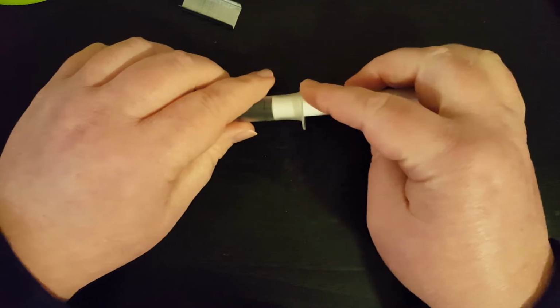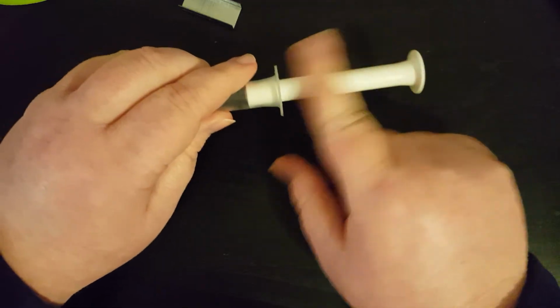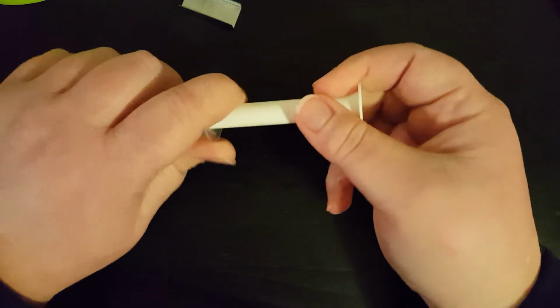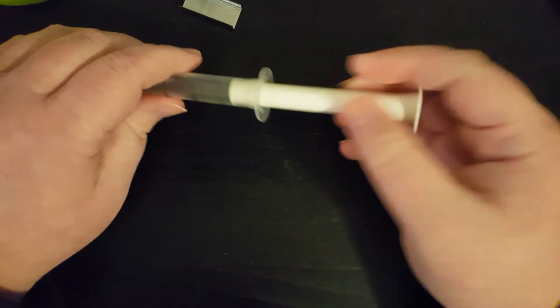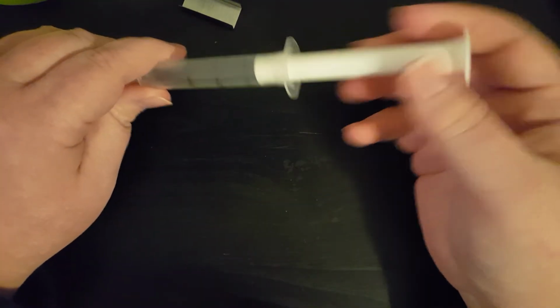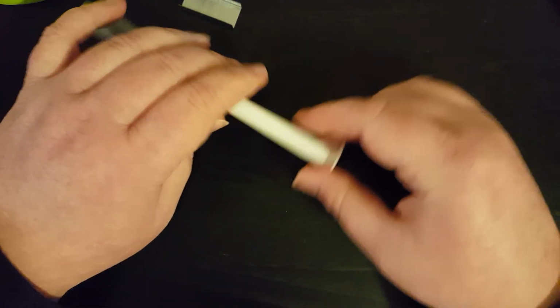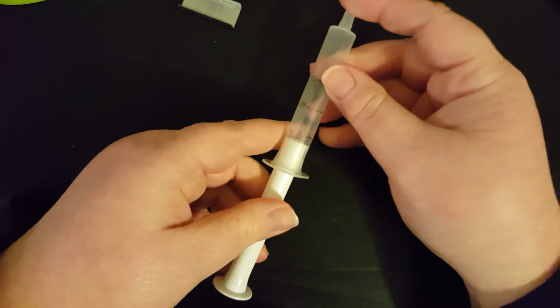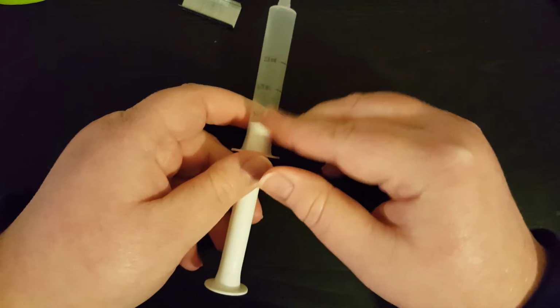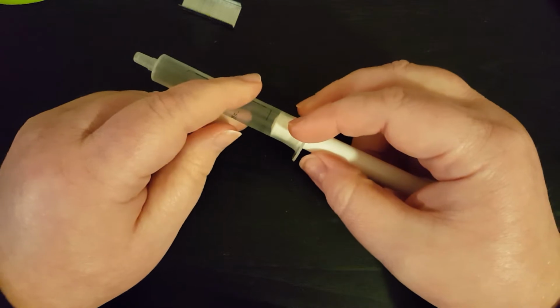And then on the opposite end of the barrel, opposite the end of the plunger, you'll meet the back of the barrel. So you have this huge gap when you pull the plunger almost all the way out of the syringe. You'll have a gap between the back of the plunger and the back of the barrel. For someone who's sighted, there is a scale of measurement on the barrel where you have to match up the end of the plunger inside the barrel, okay?